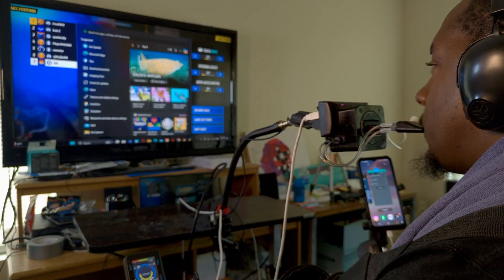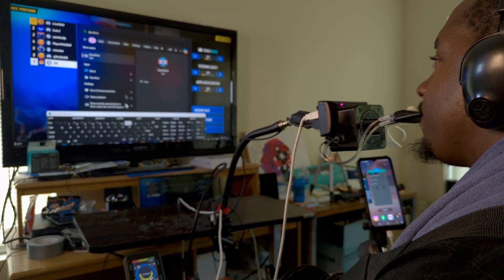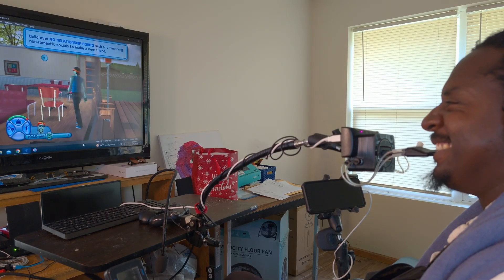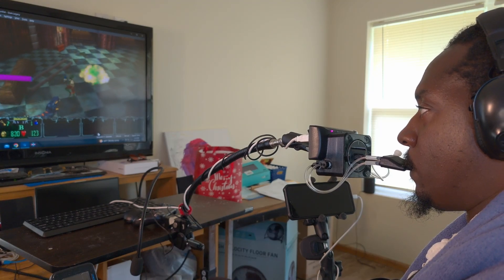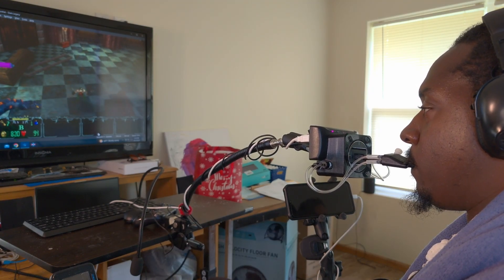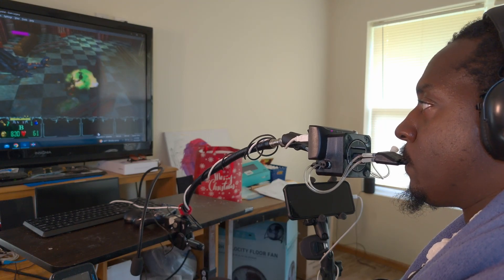He uses the Quadstick as a mouse to control his computer, type using the on-screen keyboard, and control the characters in his games. The lights at the top of the Quadstick represent different profiles. Each profile can be programmed to perform different actions depending on which tube is sipped or puffed into.